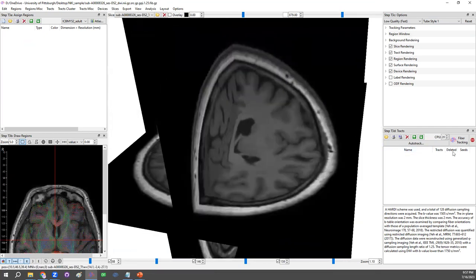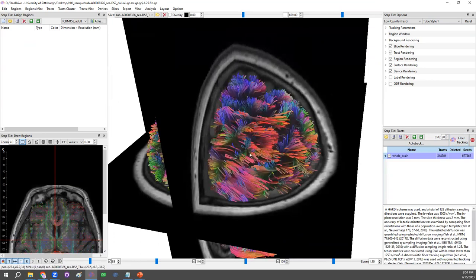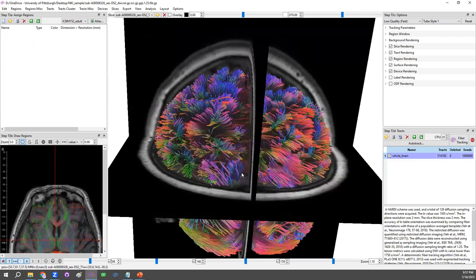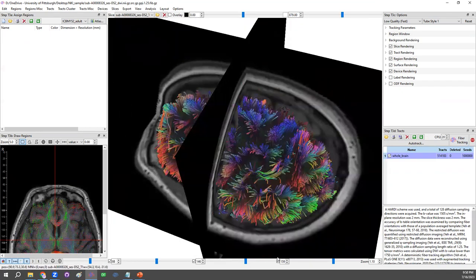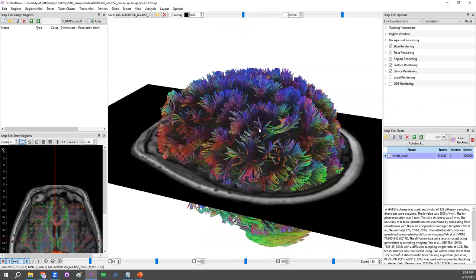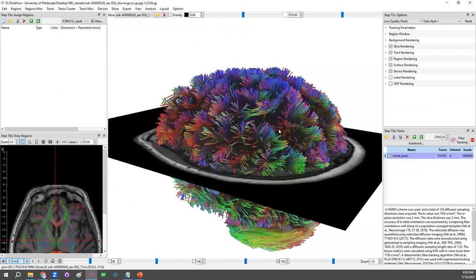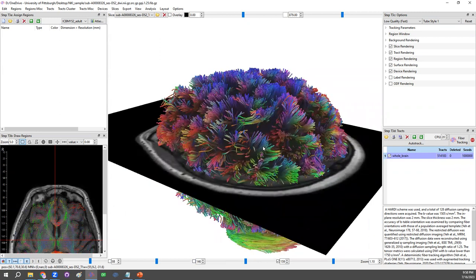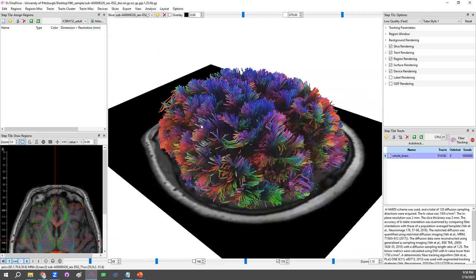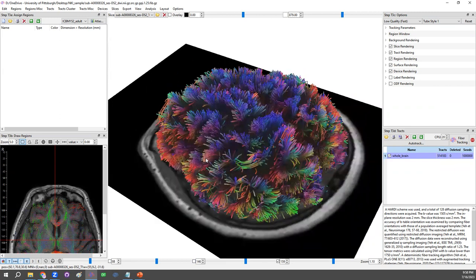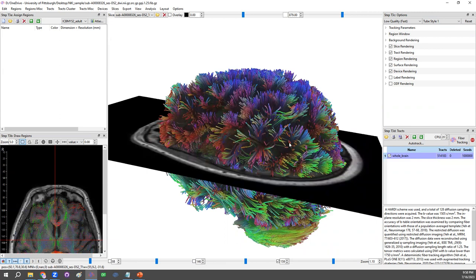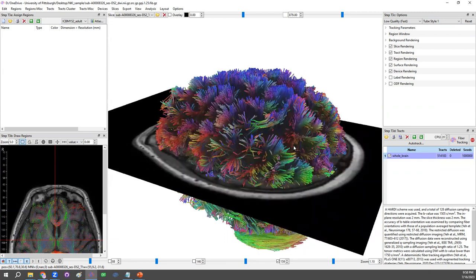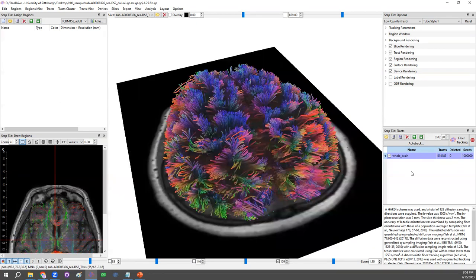And on the right corner, you will see the button that's for the fiber tracking. So here, if we just go ahead and click on this button, this is to generate whole brain tracks. That's include all the pathways within the entire brain. So in the past, if we would like to get a specific pathway, we may need to place ROI. Or either we use manual track editing to isolate or auto-segment tracks. Say, for example, the language pathway. Arcuate fasciculus is within this big chunk of tracks. And we may need to place ROI or manually do another intervention to map those pathways.